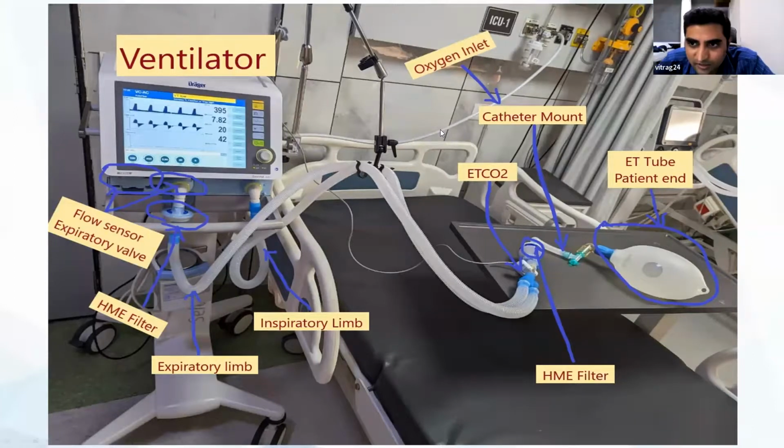I think same as you discussed. I think you want to ask about monitoring parameters. If you've got a patient on volume controlled ventilation, you know that the pressure varies. So you must measure the peak pressure and the plateau pressure, because with volume control ventilation, if there's a leak, you will lose volume. You must also measure the expired minute volume and the expired tidal volume.